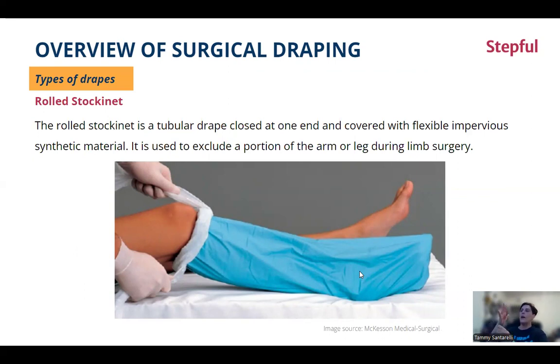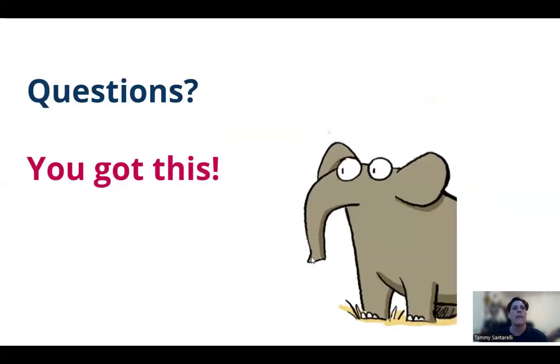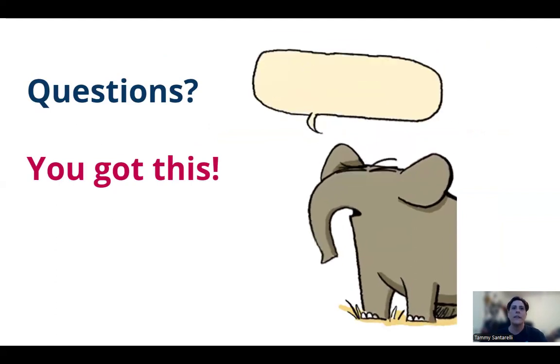Because when we prep, yes, we can prep in between all the fingers and the toes, but we also kind of think it's more germy, if you could say. And so we would cover that up and just have an extra precaution since we're going to work somewhere down in here. So this guy again is called stockinette.